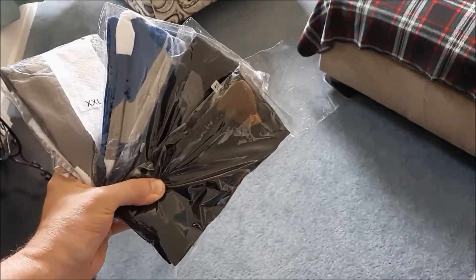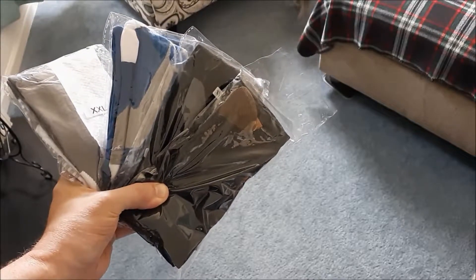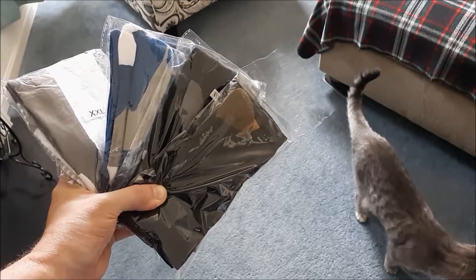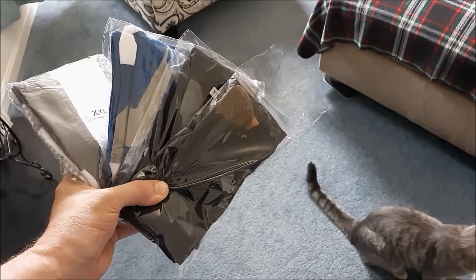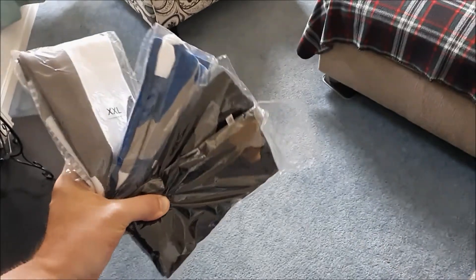I'm 53 years old and you've seen the older ones that our grandparents and parents used to wear compression-wise for diabetic socks and to improve circulation. I really didn't want to wear those out, like if I'm wearing shorts, so I decided to try some of these other ones that are out now.